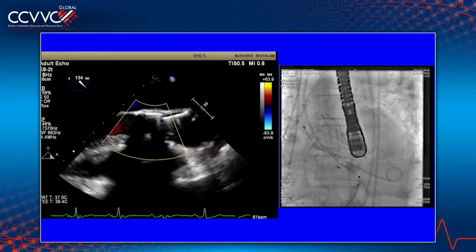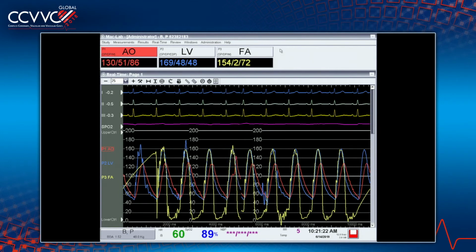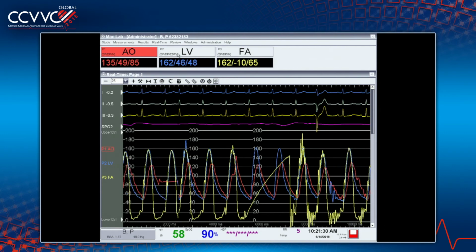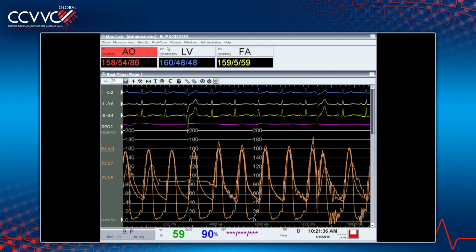Okay, are we showing the hemodynamics? We're not quite ready to show the hemodynamics yet. Look, you saw the difference, right? Looks like you still have some gradient there. No, hold on, this is just flushing and re-zeroing everything. There's no gradient. All right, well, you have to convince us of that with hemodynamics. Ah, now we go. Now we see it. Very nice. Beautiful.